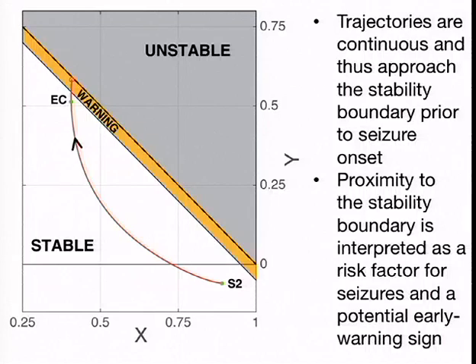And in regards to that, we set out to make a quantitative version of that schematic diagram at the start, where we could understand the changes that take place over the sleep-wake cycle, not in terms of changing between sleep stage 1 and sleep stage 2, but in terms of saying, my corticothalamic feedback strength has decreased and my intracortical feedback has increased. Mm-hmm. And in that respect, I think we've been quite successful. Okay, thanks.